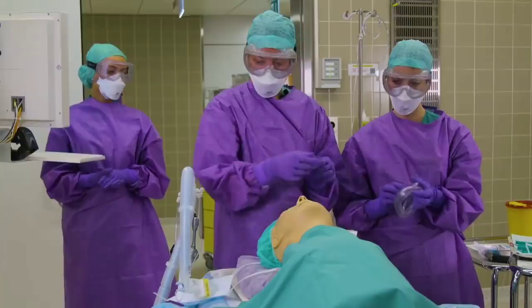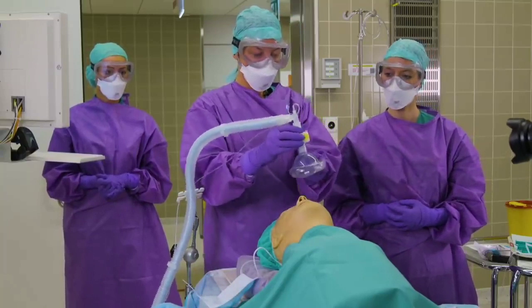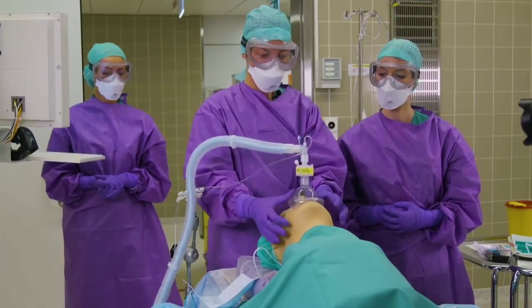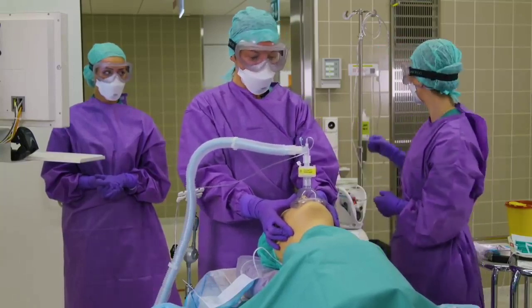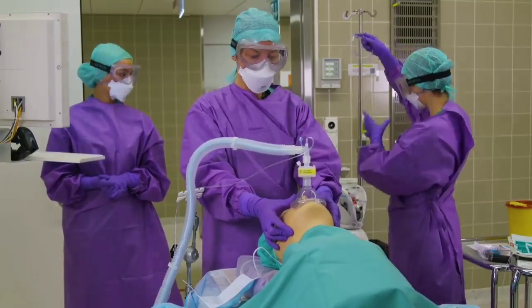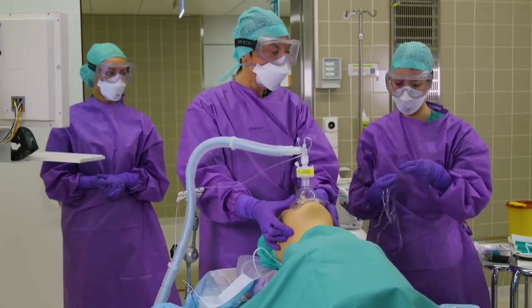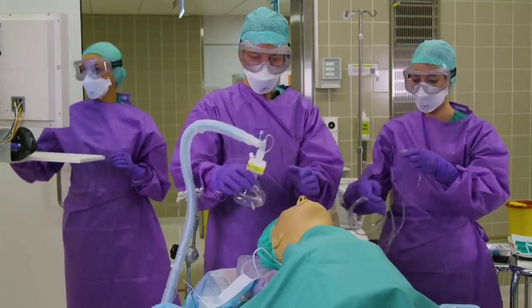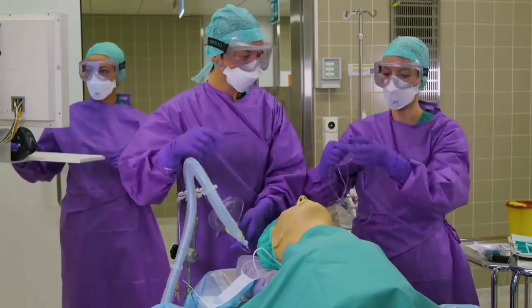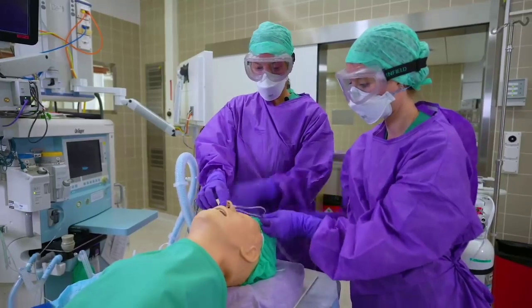We dispose of the tube right away and oxygenate the patient with a tight-fitting mask. Once the patient is adequately breathing, we are utilizing nasal prongs for transport. After the nasal prongs are on the patient, the patient will also receive a surgical face mask.